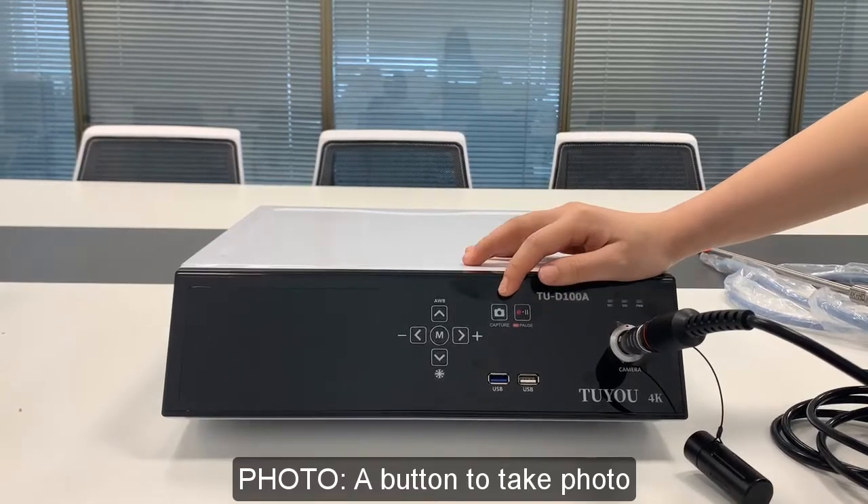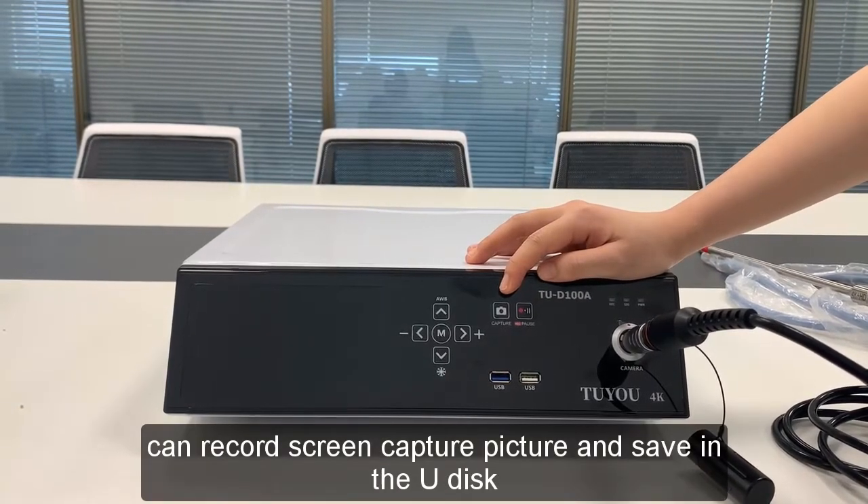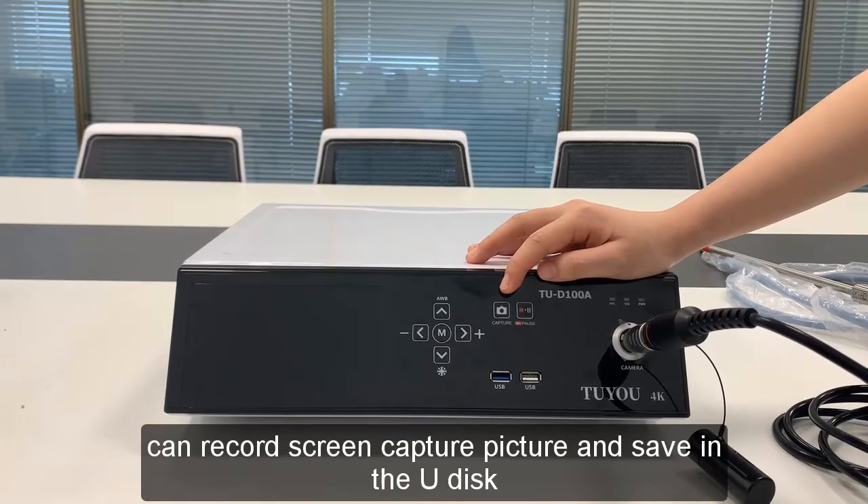Photo: press the button to take a photo. It captures the screen and saves the picture to the U-Disc.